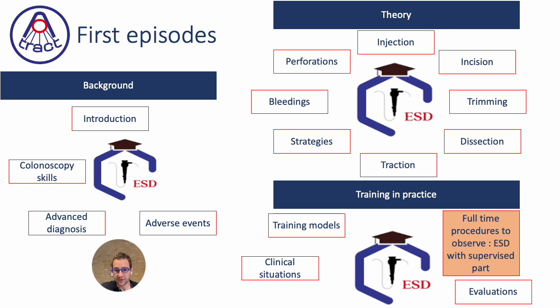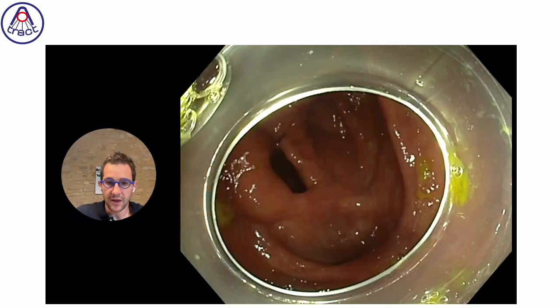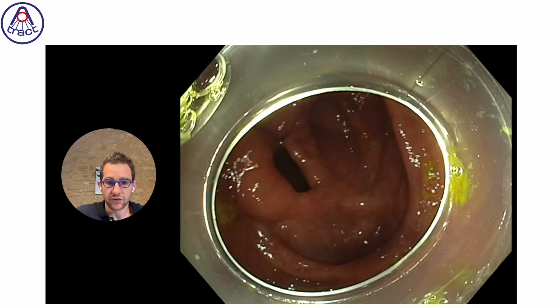So we are here in the training in practice part of the ESD school to see full-time procedures with comments without any cut. So it's the complete procedure from the beginning to the end. And we are going now to this procedure.